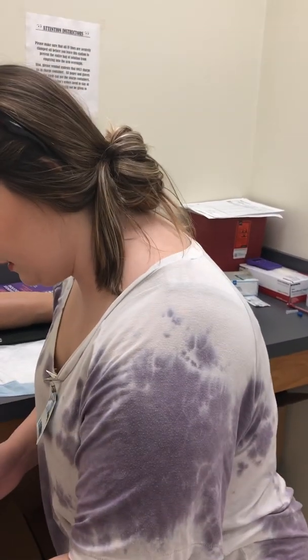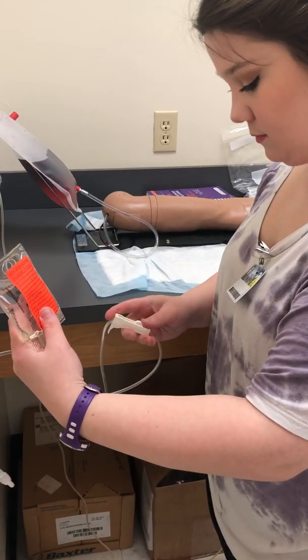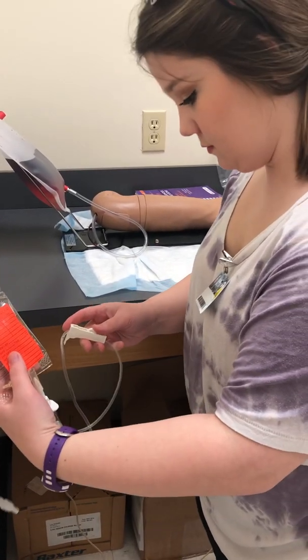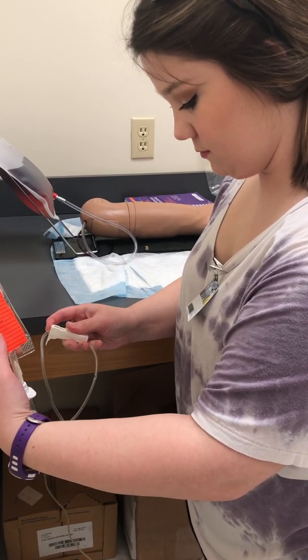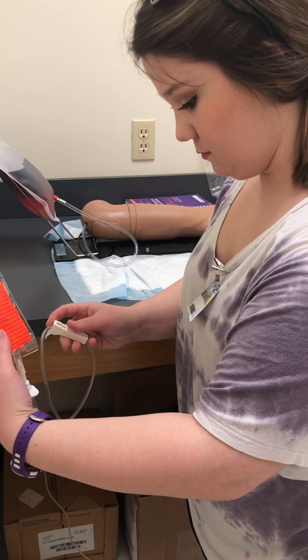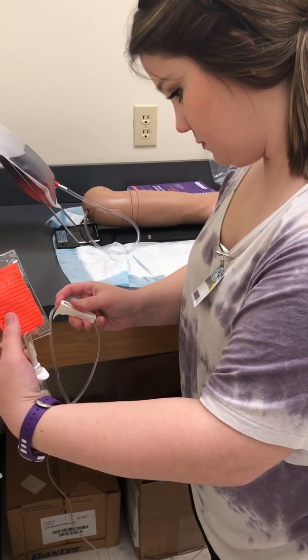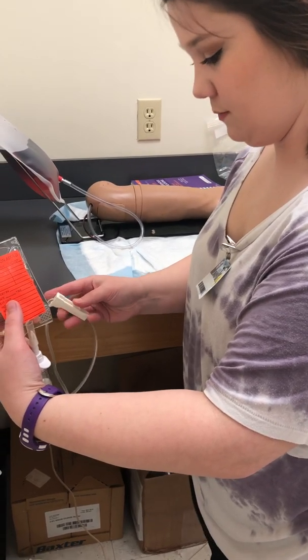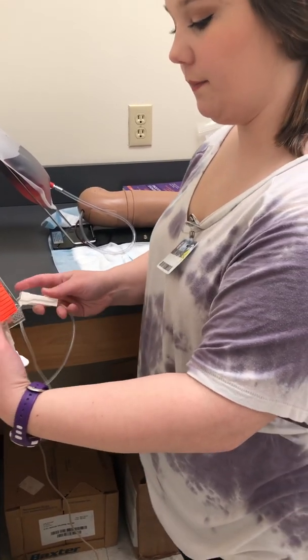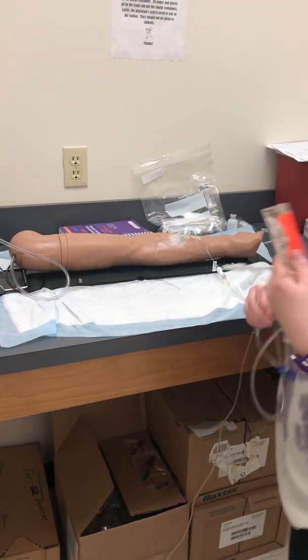Going to slowly open and prime. Clamp it back. Alright.